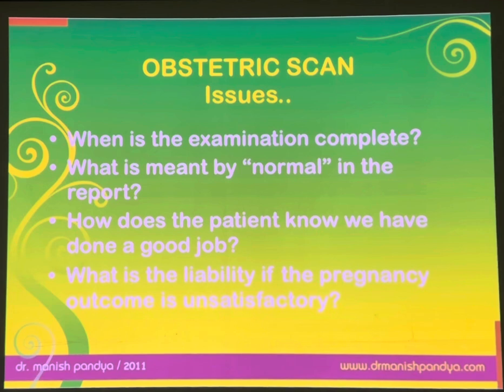The connection goes from the ultrasound machine to this HD TV, and the patient watches the whole ultrasound on that TV screen, and we can give them the recordings. But nowadays with PCPNDT we are supposed to give only images. So no live recording is allowed to be given to the patient, but we give 10, 15 or 9 images depending upon the good images we are able to capture.